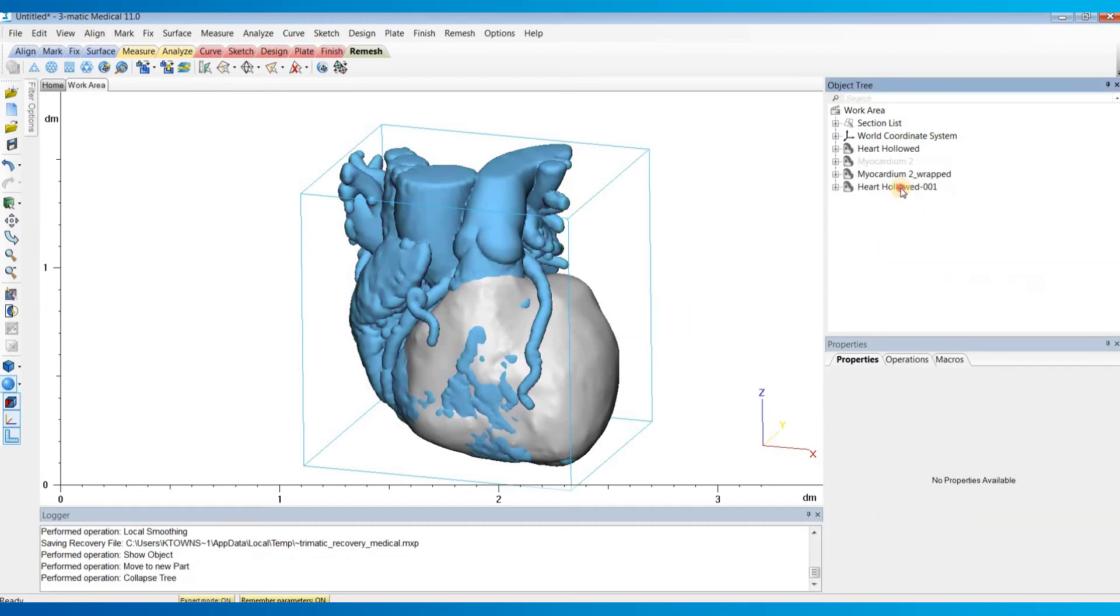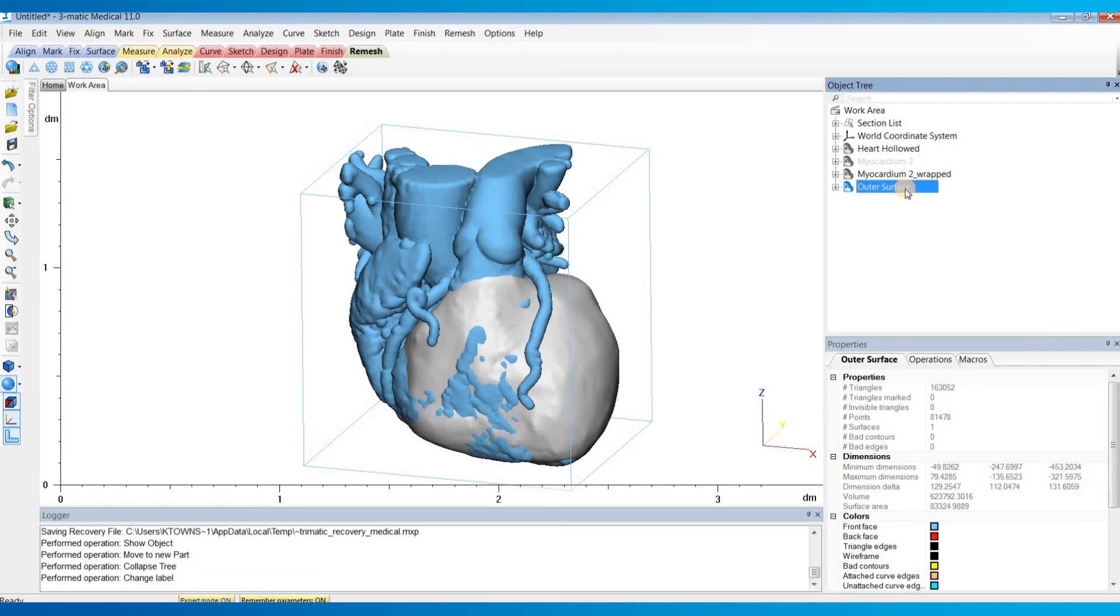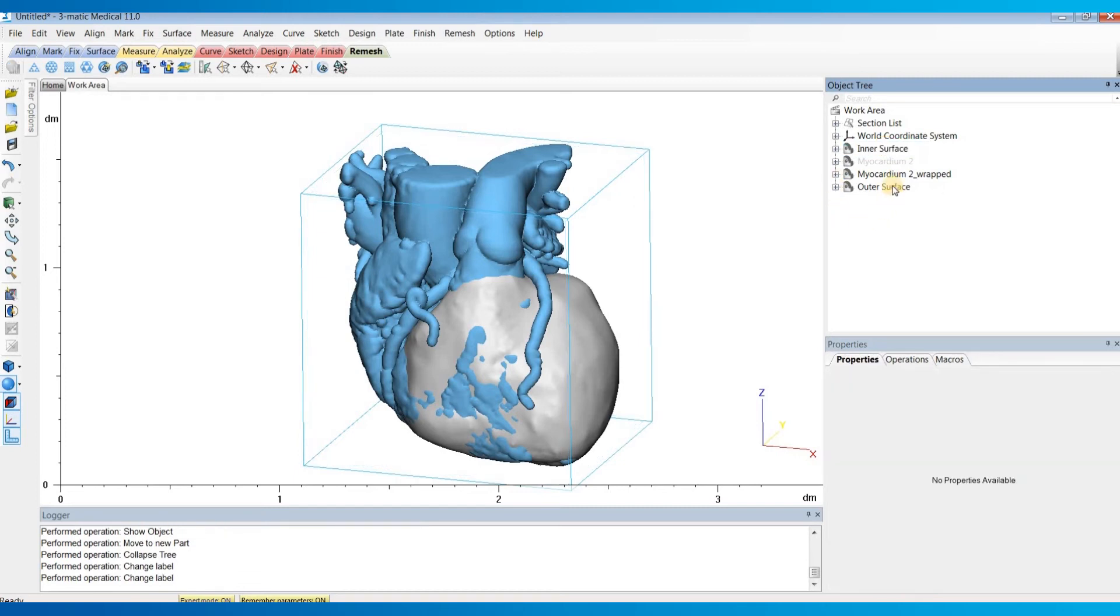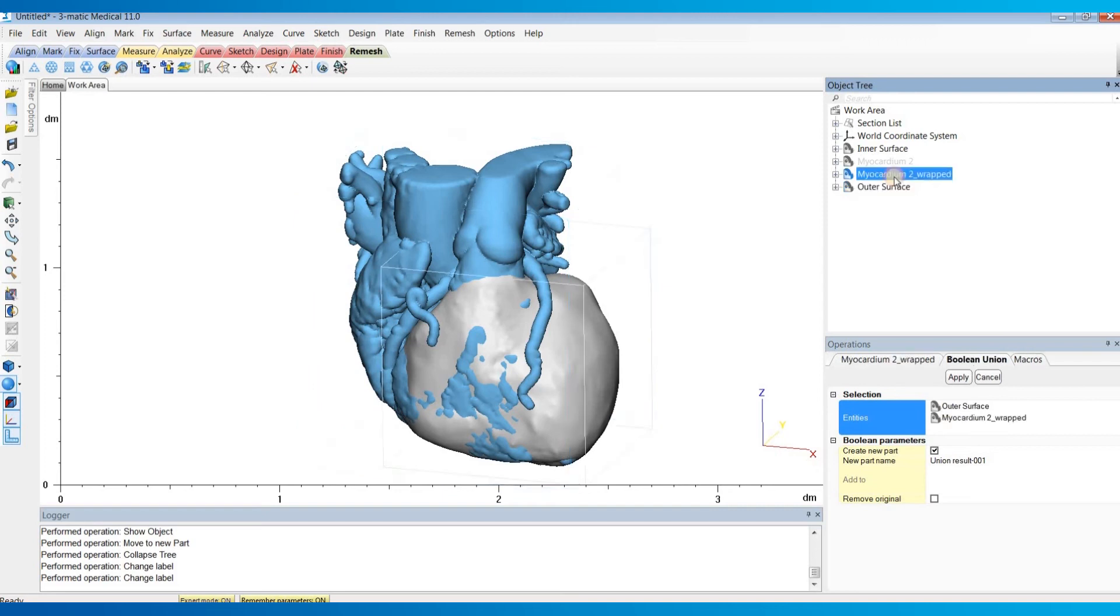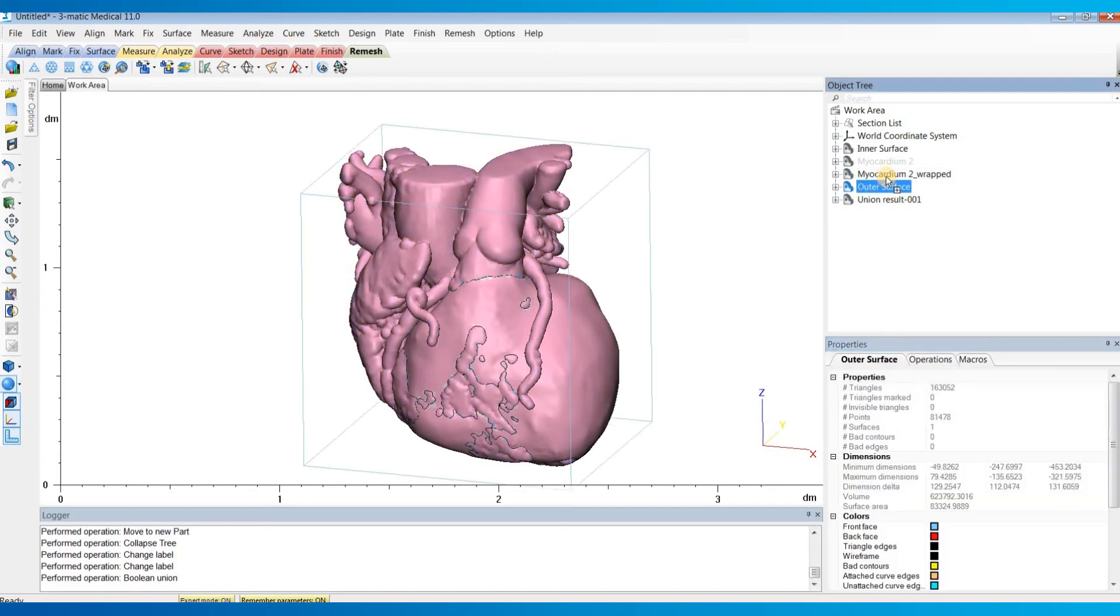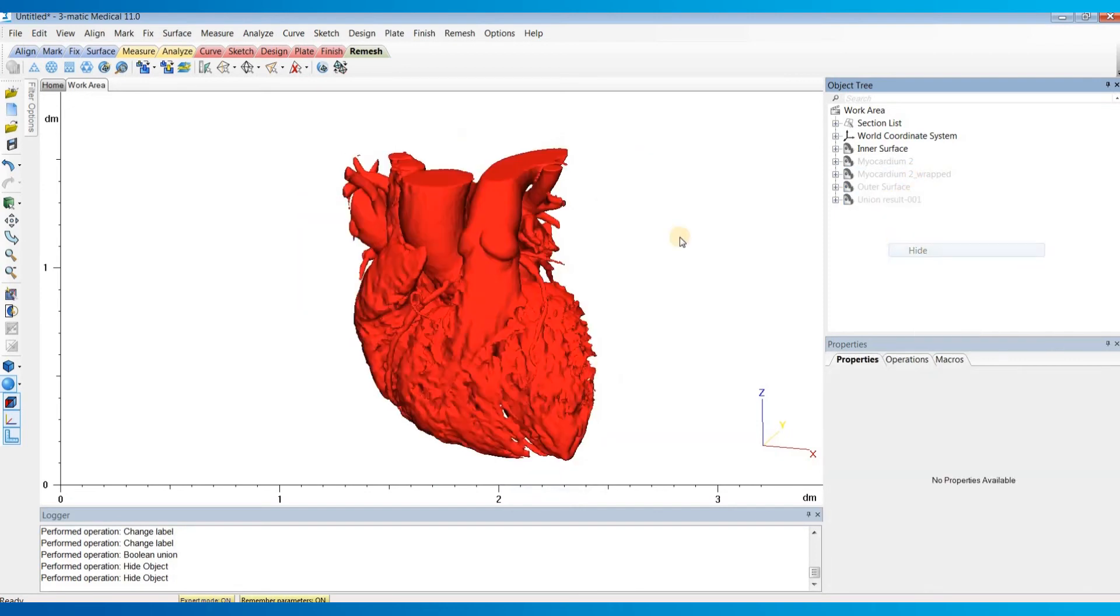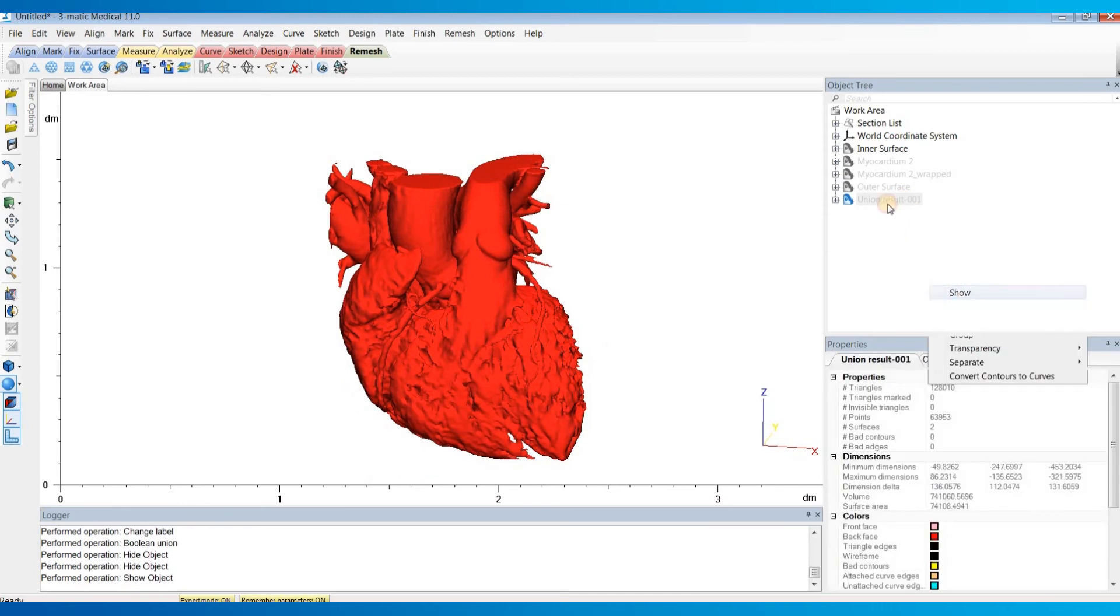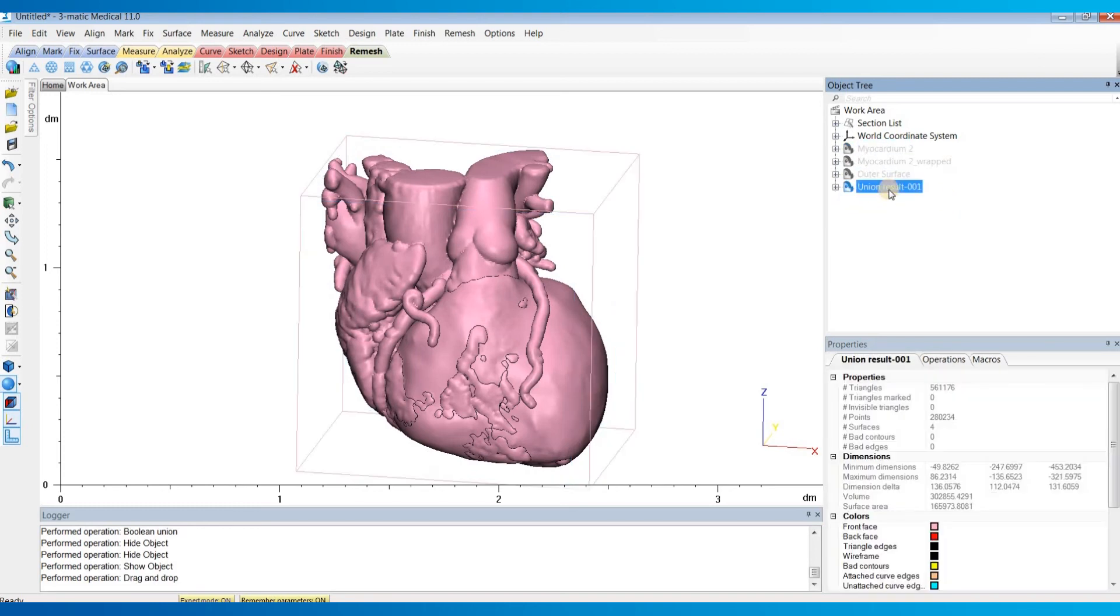I'll label this new part our outer surface. What was our heart hollowed model only contains our inner surface now. I am then going to do a Boolean Union operation with the outer surface as well as the myocardium. I'll hide those. So now we have our outer surface as well as just our inner surface, and we then simply hold down left click to drag and drop the inner surface into our Boolean Union result. And this is now our hollowed heart model with the myocardium.